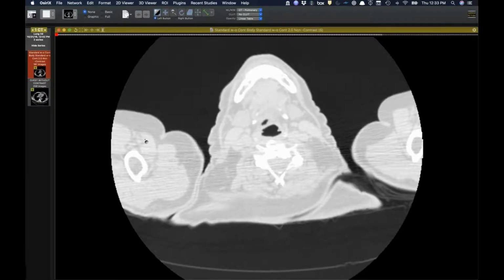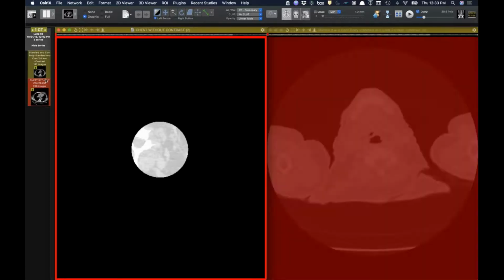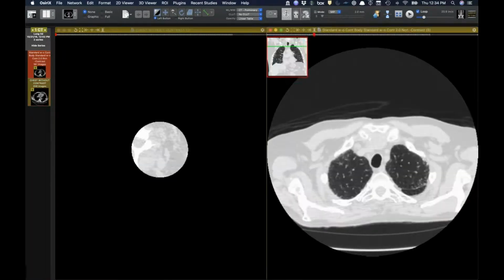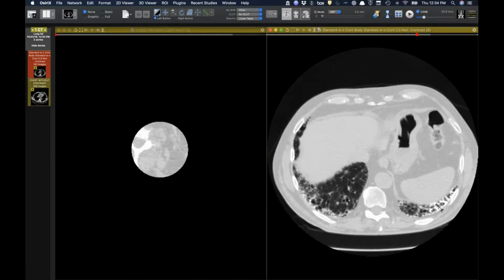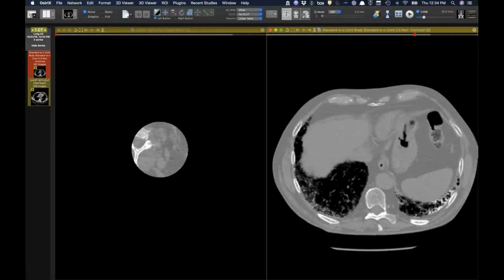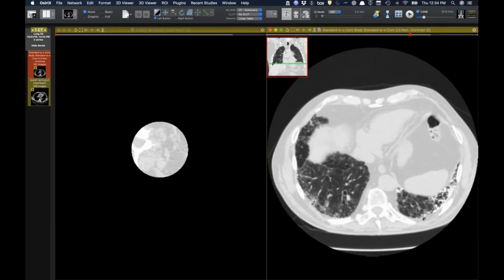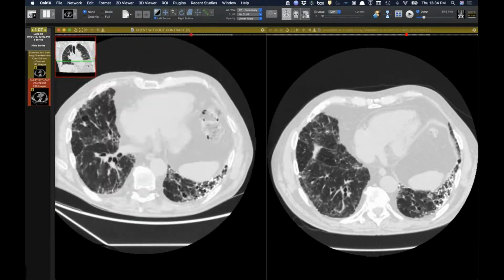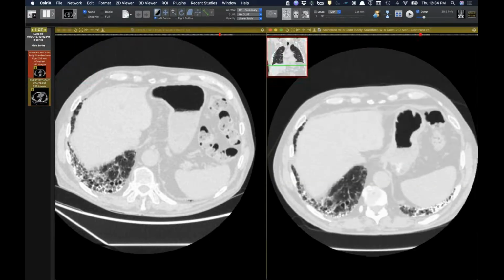This is one, I know Howard's not on, Howard had shown a case a couple weeks ago. Let me make sure I get the time of these right. He had shared a case with some of us, so I don't think he actually showed it, but this is a patient who has pretty exuberant ossification here. So the question is, is this all just related to his fibrosis, or could it be a concomitant amyloid? This guy certainly has fibrosis, and he has traction and reticulation. And it's nice because you can see in 3 years how this has progressed significantly. But I would say this is probably just all due to the fibrosis, since the fibrosis is worsening.